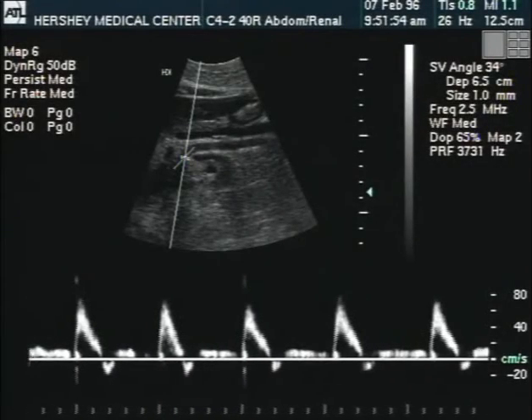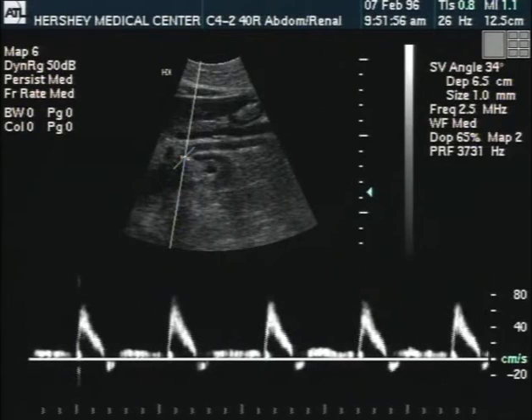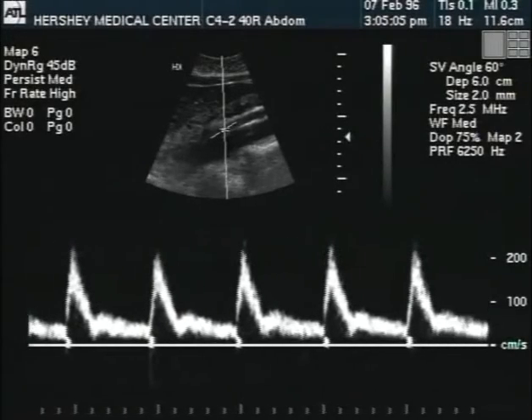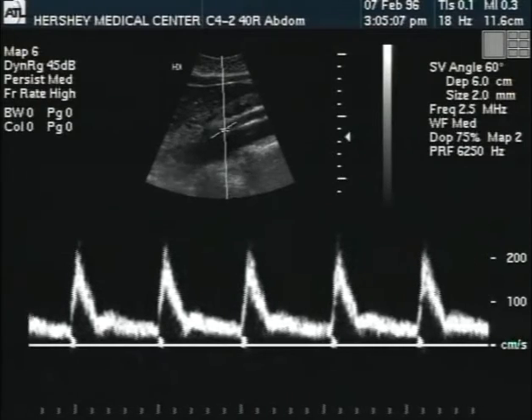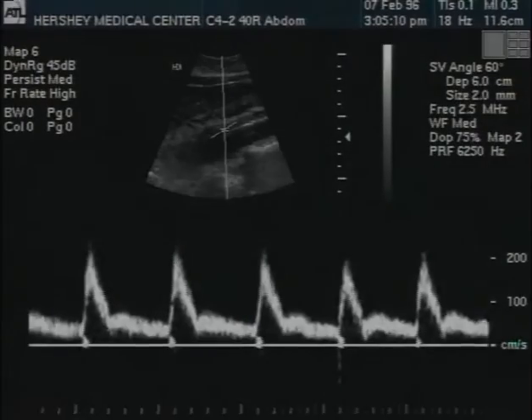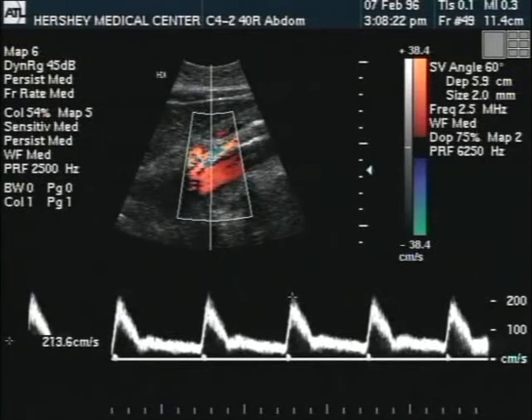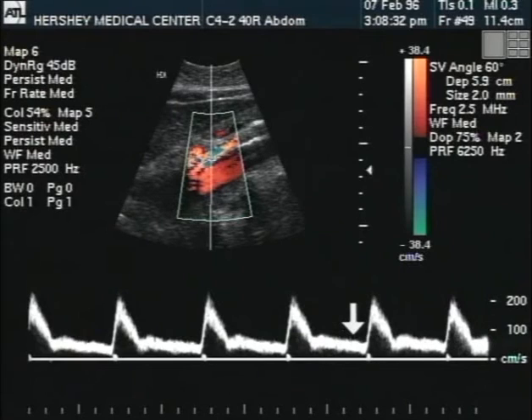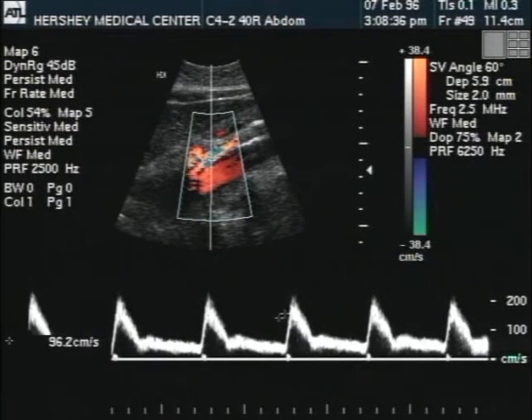Following a meal, the vascular demands of the digestive organs change from high resistance to low resistance, and blood flow increases to meet the metabolic demands imposed by digestion. Postprandially, we should notice an increase in the peak systolic velocity of the SMA, but the most notable response occurs in the diastolic component of the waveform. Diastolic velocity usually increases by more than 50 percent following a meal.